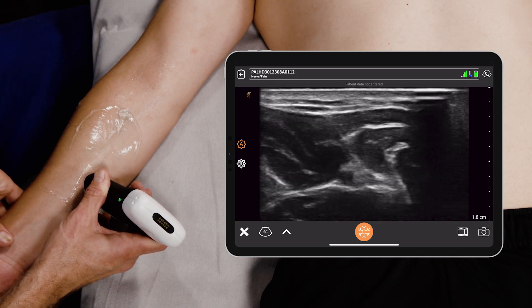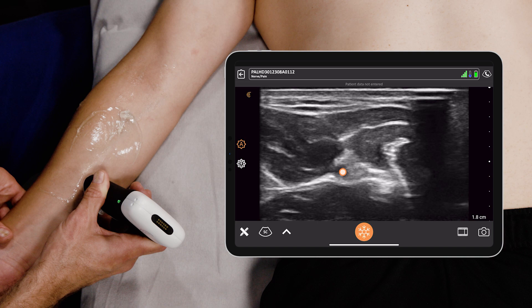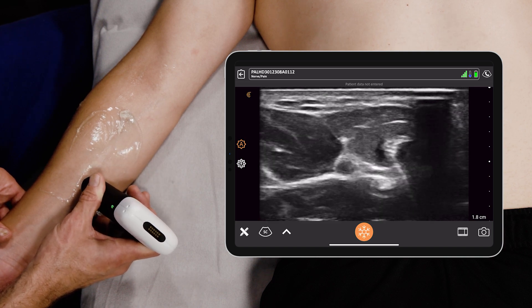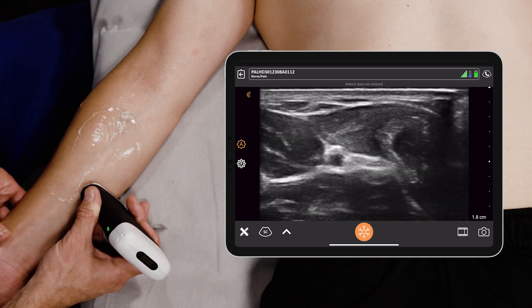You see a pulsatile structure, and surrounding it is the ulnar nerve — it's ulnar to the ulnar artery. An interesting thing about nerves is they're sort of honeycombed, they're bright, and they have what's called anisotropy. So when you rock up and down, they can sometimes get brighter and darker.